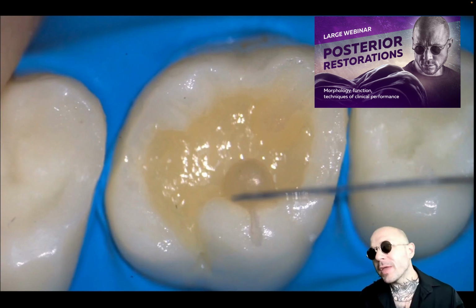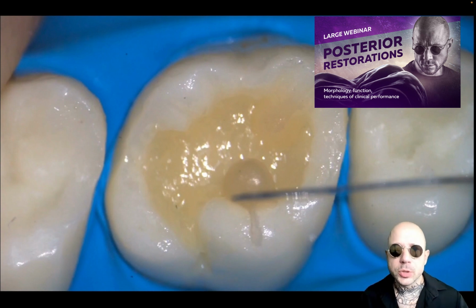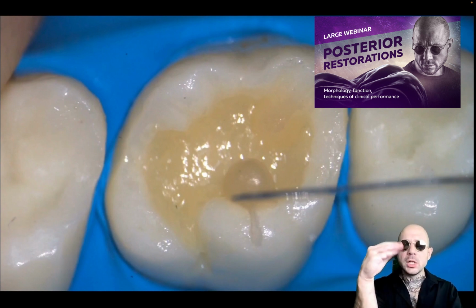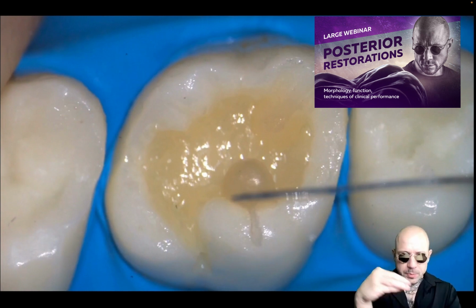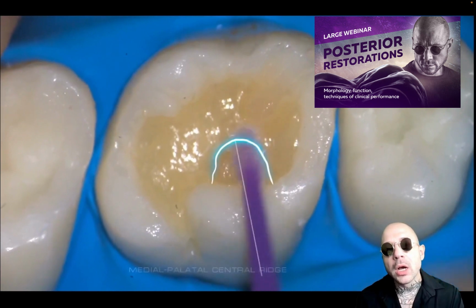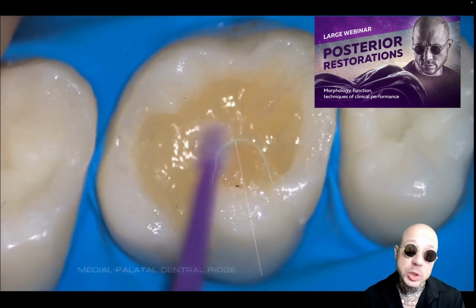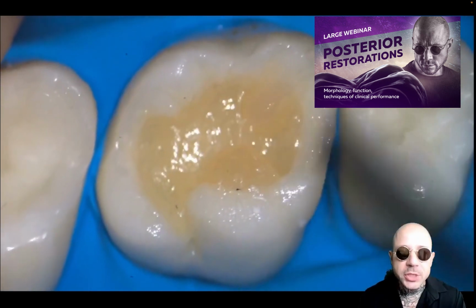There are actually not that many ways. One of the ways is based on using specific instruments, the working part of which is located at an angle of 90 degrees to the holder. And for example, one of the instruments I widely use for this purpose is fissura, having exactly that configuration I need.